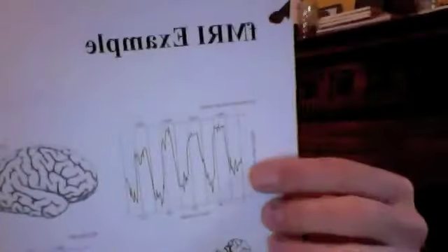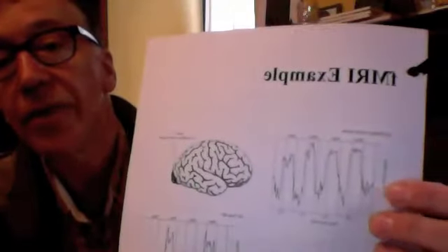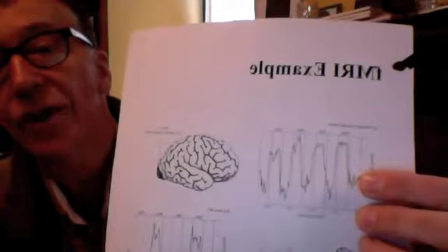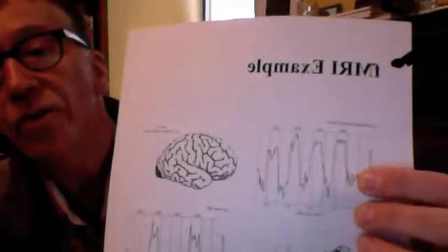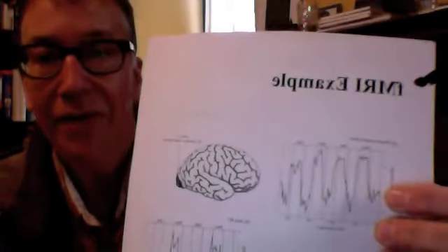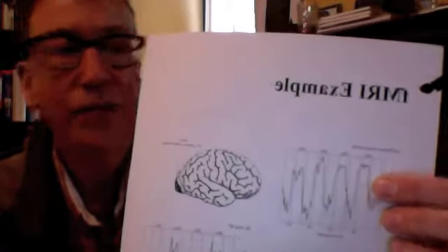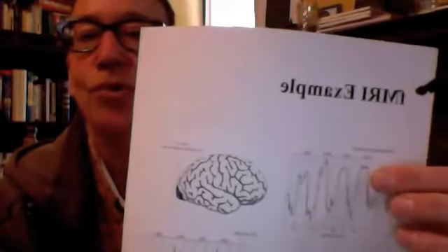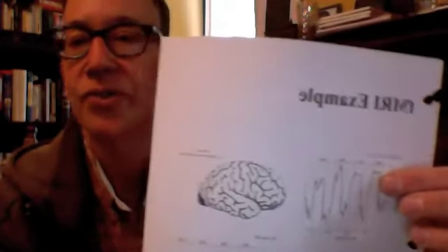So this is looking at the fMRI signal, percent signal change from the period before. This is the blank background, the stable state. If you're showing nothing there, this is the signal you're recording. Now these are moving dots, and this is from primary visual cortex. You see this increase in the signal.